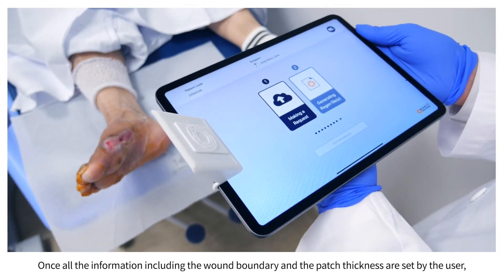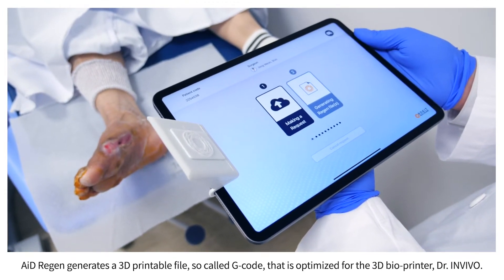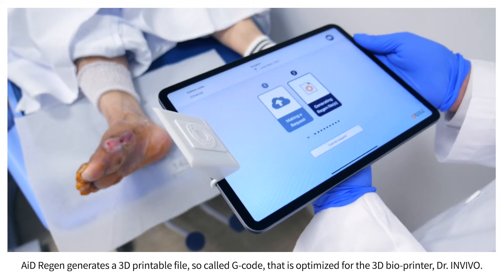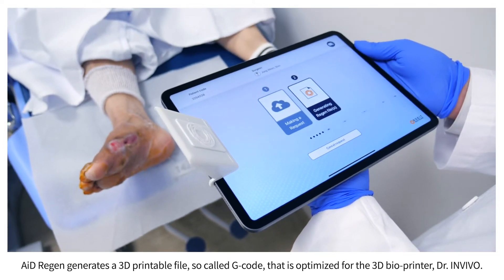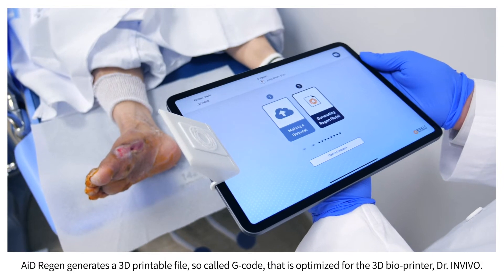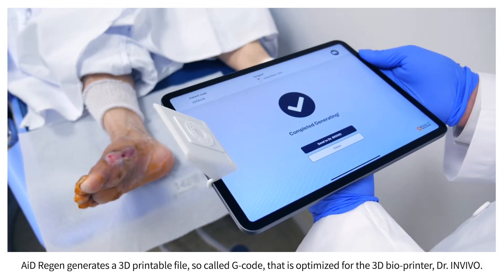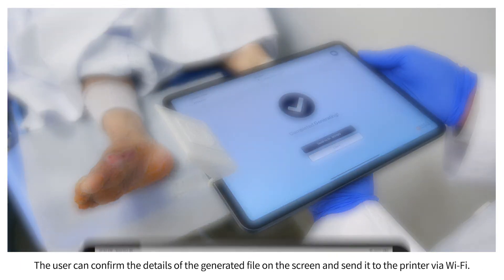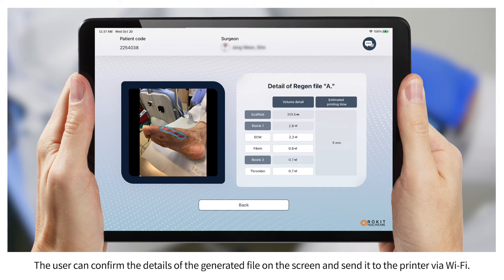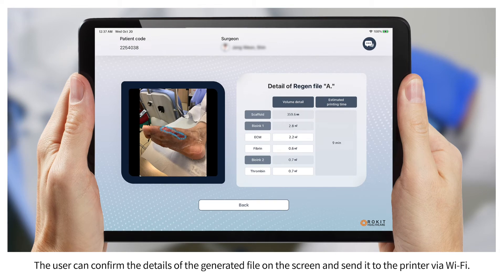Once all the information including the wound boundary and the patch thickness are set by the user, AID Regen generates a 3D printable file, so-called G-code, that is optimized for the 3D bioprinter Dr. In Vivo. The user can confirm the details of the generated file on the screen and send it to the printer via Wi-Fi.